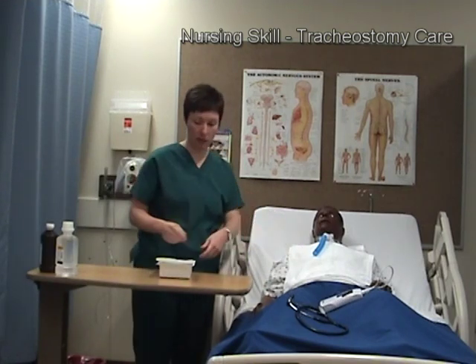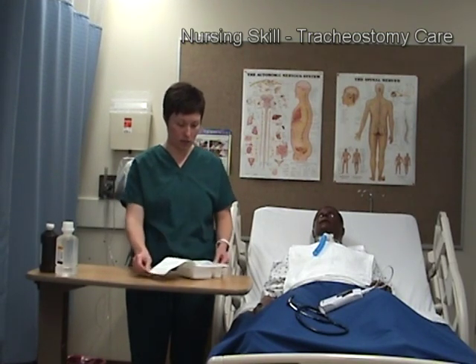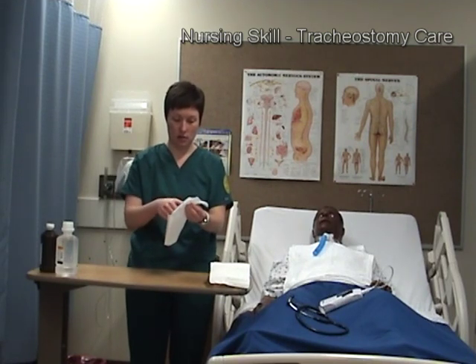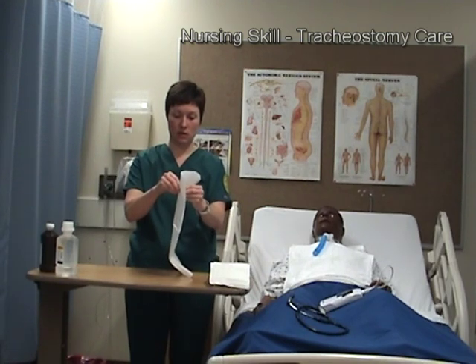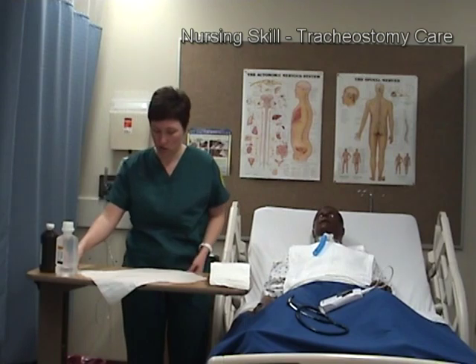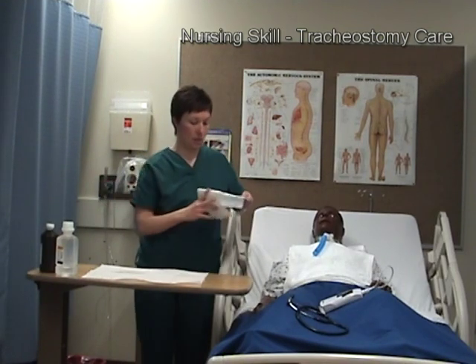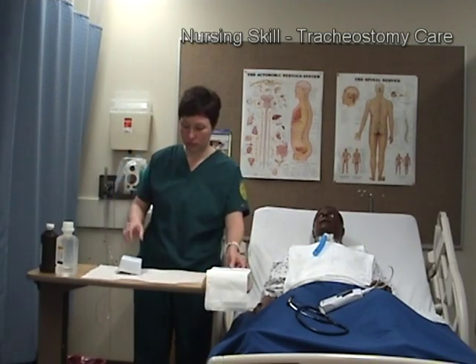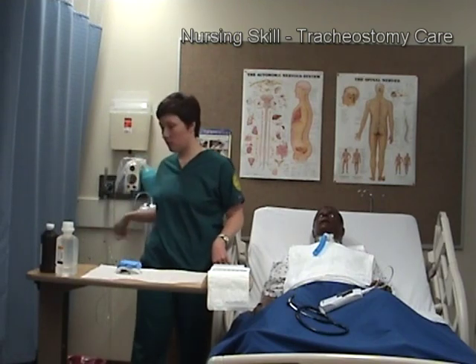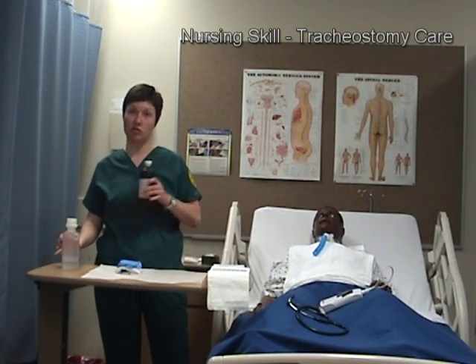I've assessed the patient's pain level, explained everything to them, and now I'm going to set up my trach kit. I have a sterile kit here. Inside this kit there is a sterile drape, which I'm going to use to maintain my sterile field. I will cut my supplies out, moving around rather than over the sterile field. For this video, I have pre-opened hydrogen peroxide as well as normal saline.